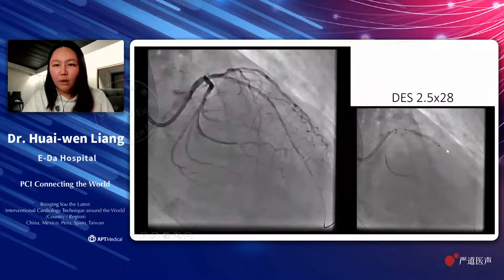First of all, I put a stent over proximal to mid LAD. Why did I put it over here? Because I was concerned this has a few plaque burden over here. Also, the distal vessel was very small, but it was due to negative remodeling, because there was very, very little plaque burden from the IVUS I just showed.